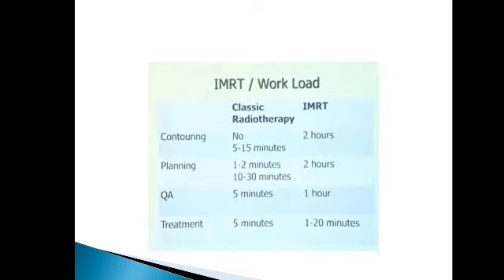Okay, and you can compare the benefit of IMRT with classic radiotherapy. In classic radiotherapy, contouring, planning, quality assurance, and treatment time are all different.